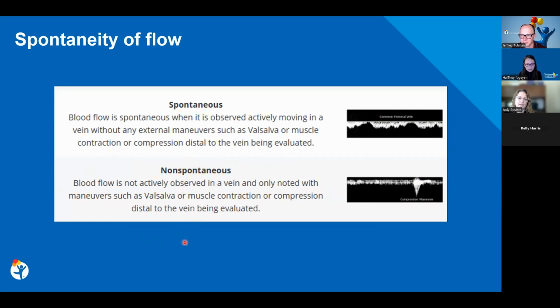I think we still do it. And I think maybe it's an argument against having to sample the distal calf veins. If you can squeeze the calf and there's transmission, then in theory there's no thrombus in the calf veins. That's how I understood it.